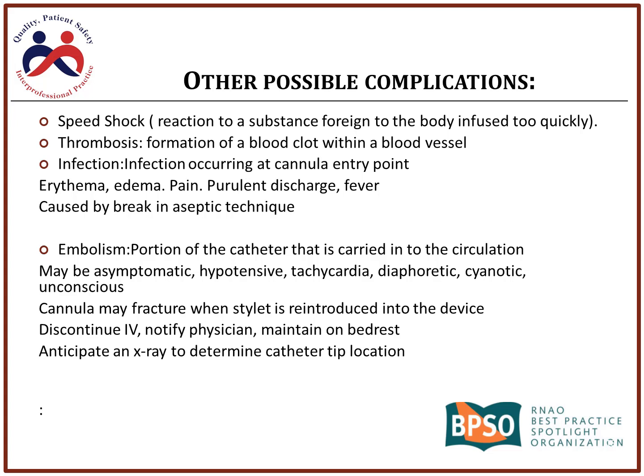Infection, so you can look for the redness, the pain, the purulent discharge, fever, all those things. Usually it's caused by a break in aseptic technique. So we want to make sure when we're doing this IV initiation that we're aseptic when we do it. Part of that, you'll see in the video, is always wear gloves. I know we're in an age right now where we're very concerned with PPE, but we should always be concerned with PPE. With patient bodily fluids, we have to protect ourselves because we don't even know what the next thing could be. So when we're handling fluids, we always have our gloves on.